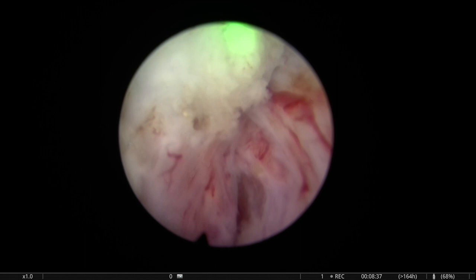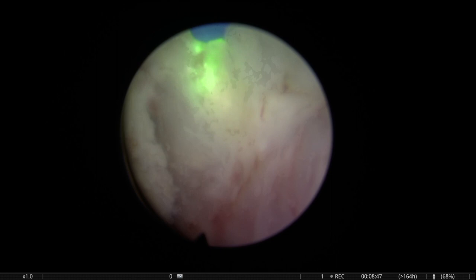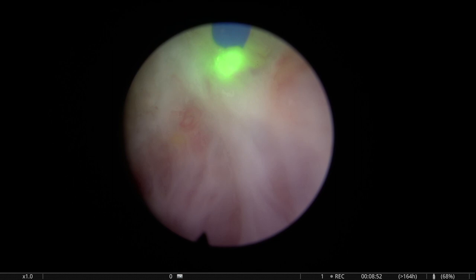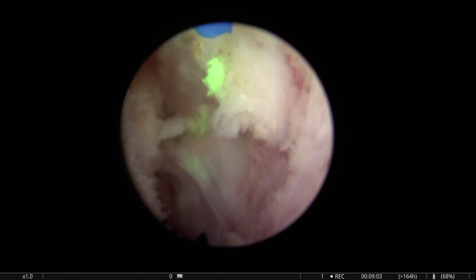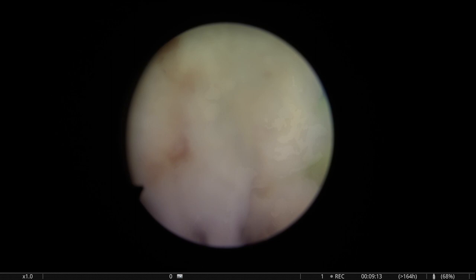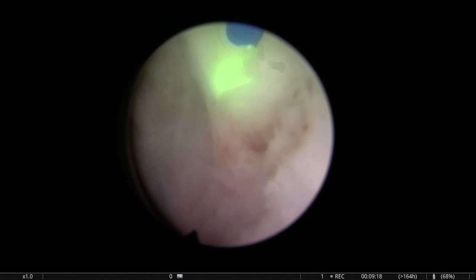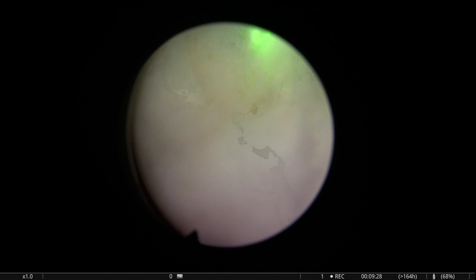So you see, initially, of course, I tried to cut on the adenoma and to release the adenoma from the capsule. But sometimes it's not easy to find where is the good plane. And in this case, it was remarkably like that. I found a plane, and then I realized that there were nodules there. So you see here, I'm coming back. This is a smaller nodule than the other side, but it's exactly in the same symmetrical position. There it goes. And here I'm correcting the plane again. So you have to be careful at the apex when you have these nodules, because of course you want to protect the sphincter at all costs. So you have to be very careful.